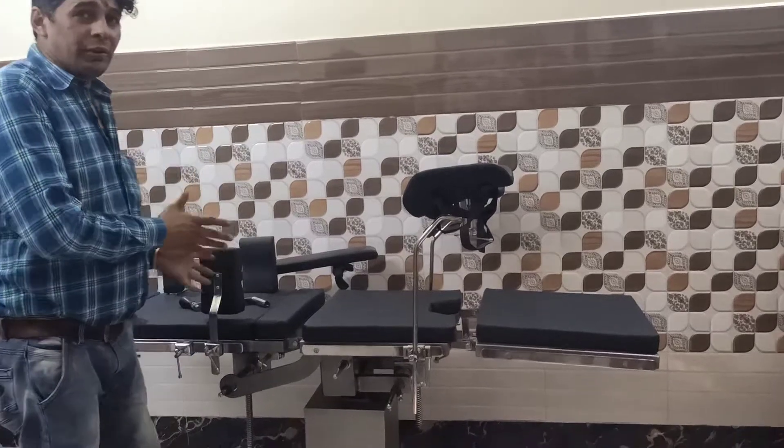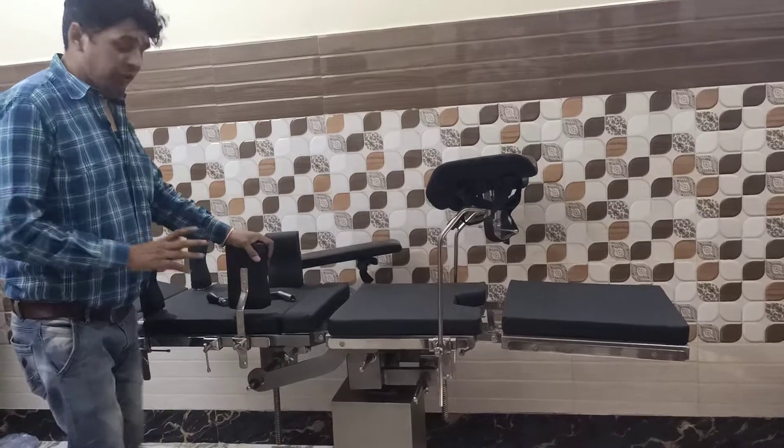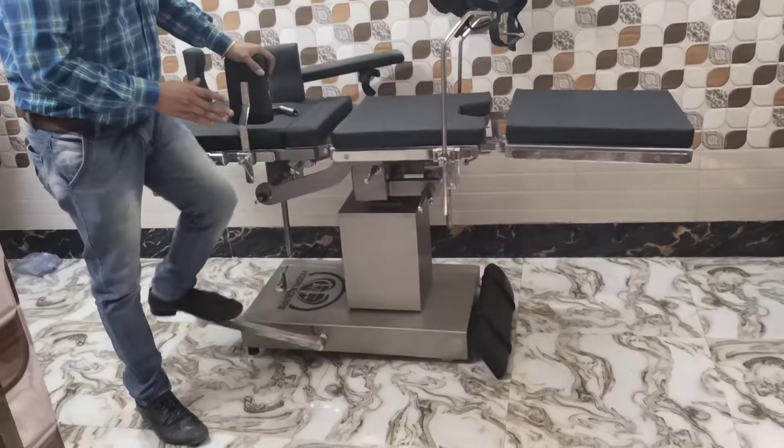For speed, let me introduce our hydraulic general surgery O.T. table. It is working with the hydraulic kick system.